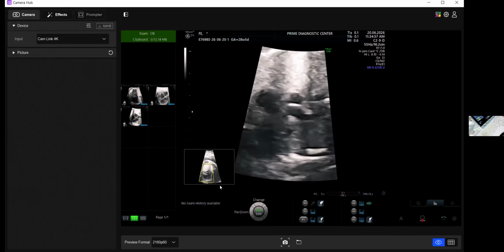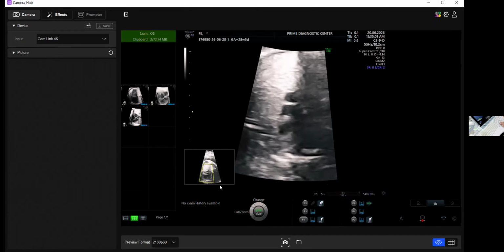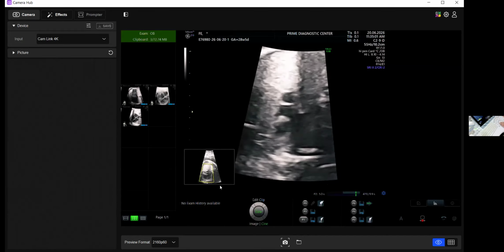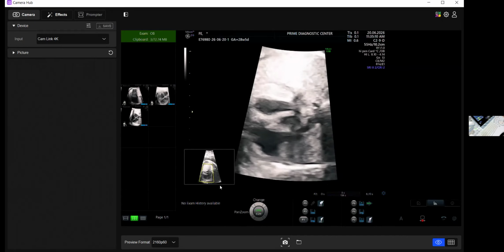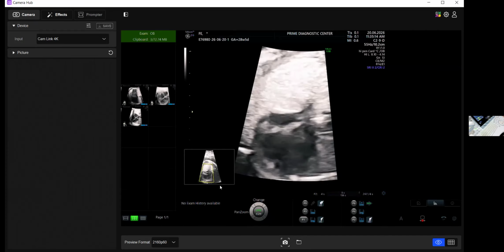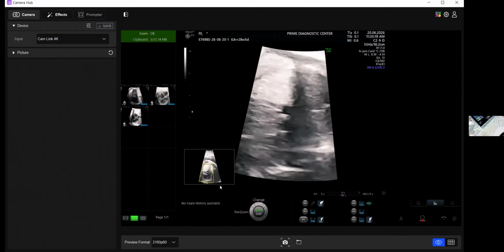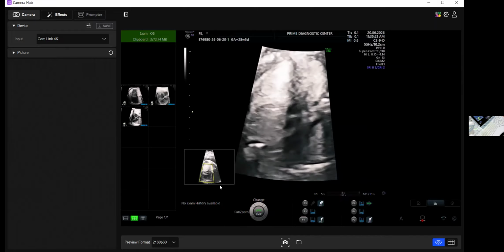And what else? We have a slightly dilated SVC. I do not know the reason for that. And see, this is an SVC. The SVC should be smaller than aorta, but I think it's smaller than aorta anyway. So that also is normal. Sorry, but I'm just thinking loud, right? So I autocorrect myself many a time when I'm thinking loud.